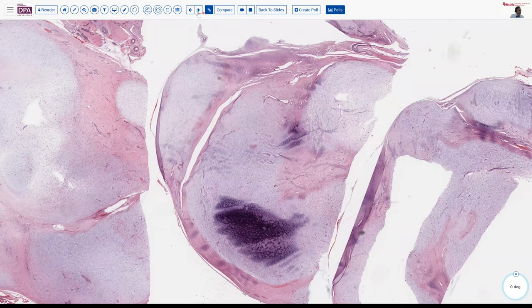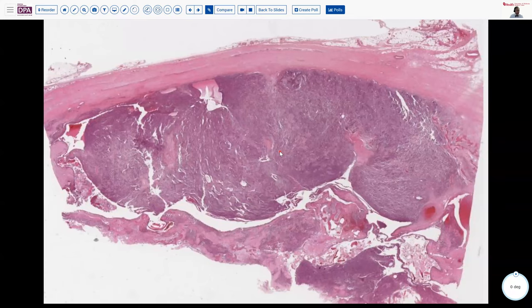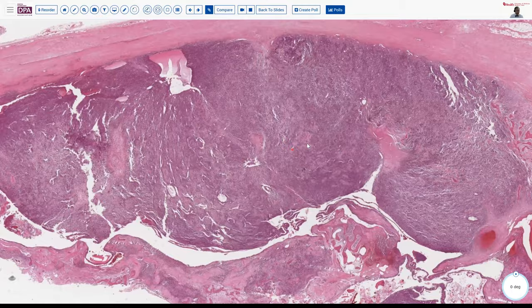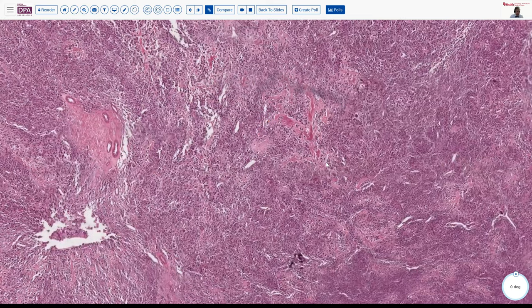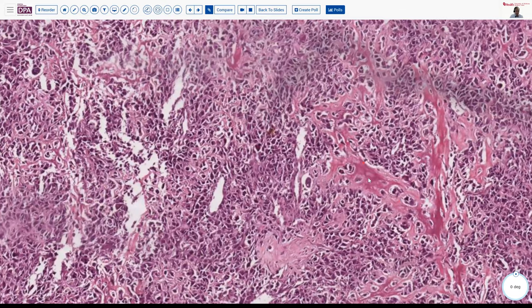Okay, we're right at 8:15, but I'll go just for a second briefly to the conventional osteosarcoma case. This is presented for you to recognize that conventional osteosarcoma, you can have very cellular areas, but here again, for contrast's sake, we see this osteoid formation with associated very atypical osteocytes within the osteoid. So this is clearly a bone-forming neoplasm.